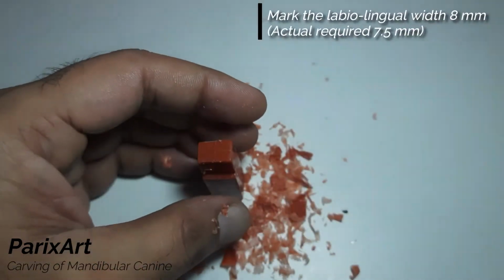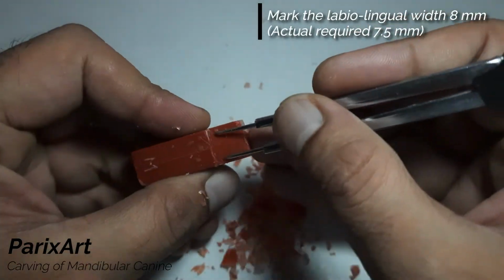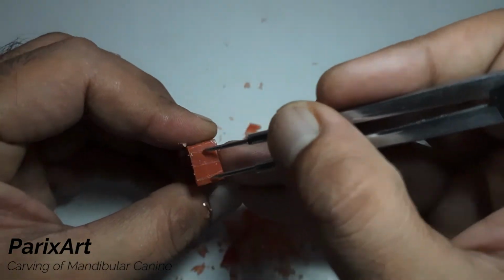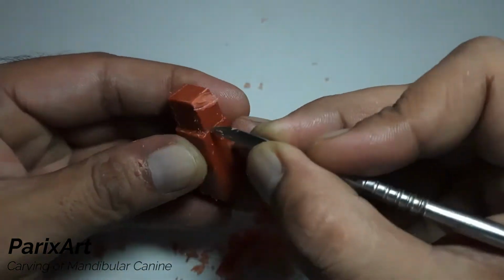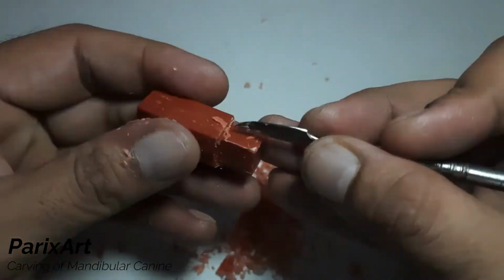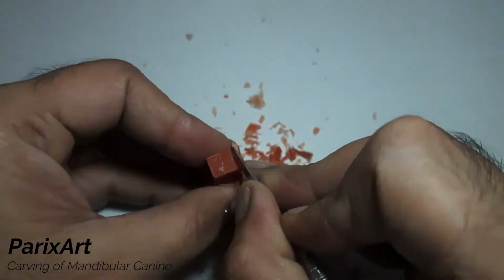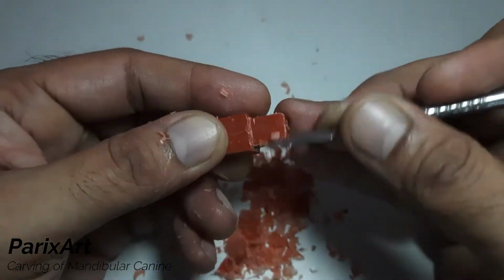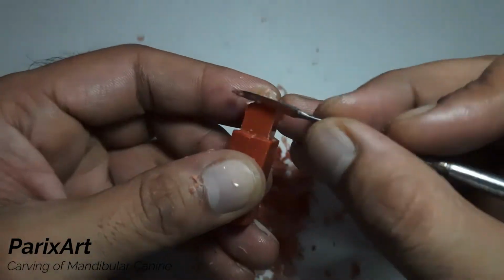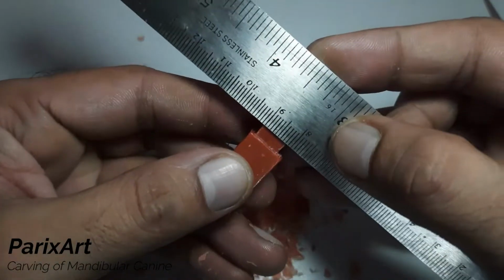Mark the labio-lingual width of the crown, that is 7.5 mm, but we'll take a little extra to 8 mm. Mark it on the top of the block and also on the opposite side. Now we'll cut straight down the markings of the crown length to make a cuboid. Make straight parallel walls within the marked dimensions. Keep verifying the required dimensions.